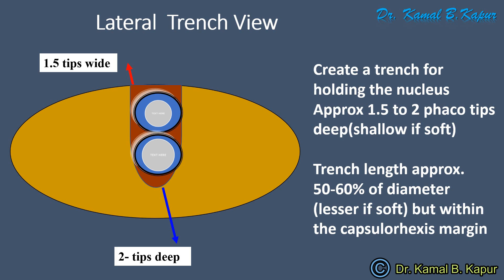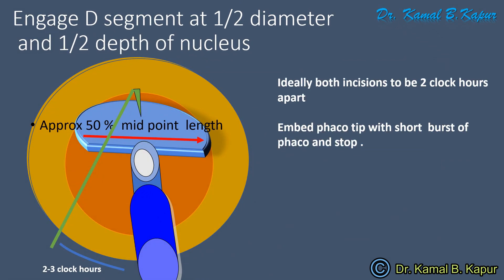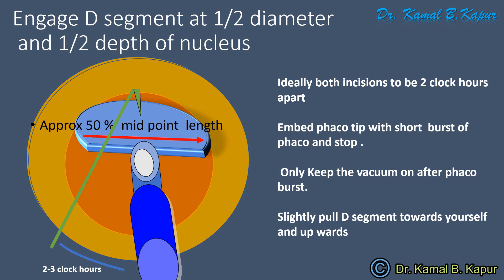Once you've done that, you divide the cataract into two pieces and rotate the segment. Now you have two D segments. Embed the FACO tip again in the central part of the diameter of the D segment and also the middle of the meat of the D segment. Now embed your FACO chopper right in front of the FACO tip, dip it deeper into the meat of the nucleus and separate your chopper to the left and move your FACO tip to the right. This will create a second chop.